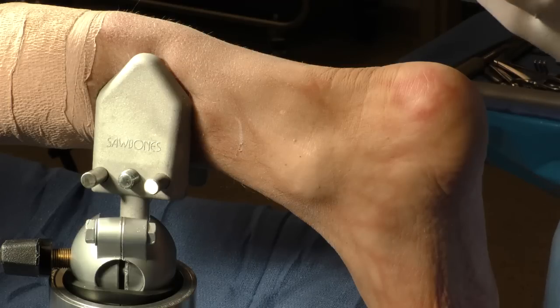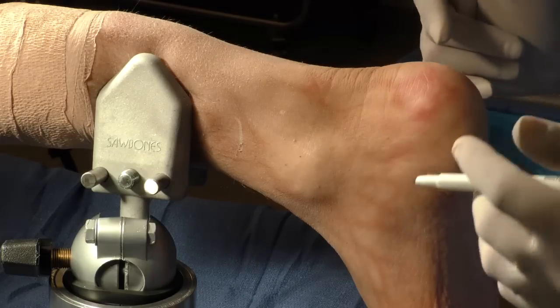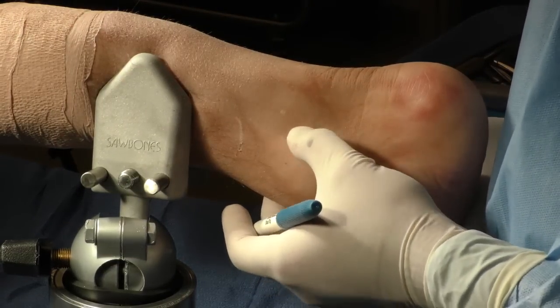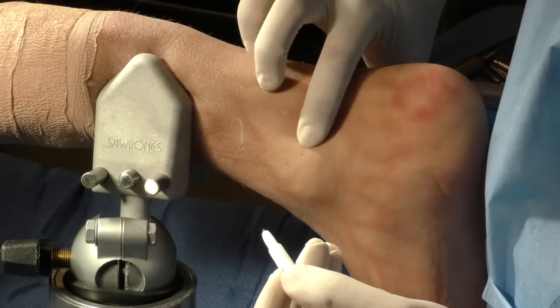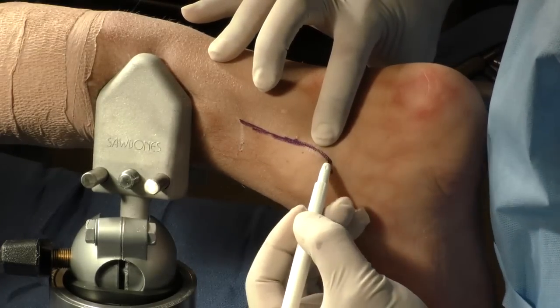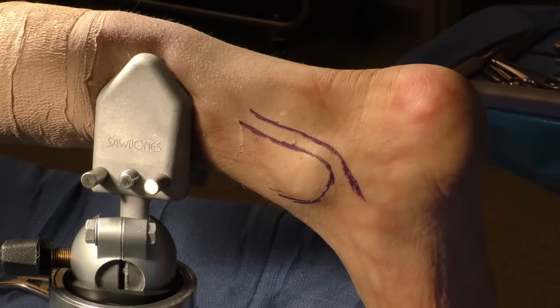You can see here, I'm going to diagram out the distal tibia — see our contours. I think we all know this anatomy. Immediately adjacent to the posterior tibia is the posterior tibial tendon. This approach is done immediately adjacent to the posterior border of the tibia, and that keeps you out of the neurovascular bundle. There's really no stress and it's a very easy approach in the prone position. I like to make my incision between the posterior tibial tendon and the posterior border of the tibia. You can make this incision as long as you want, but it really doesn't have to be that long because this fracture is typically quite short.